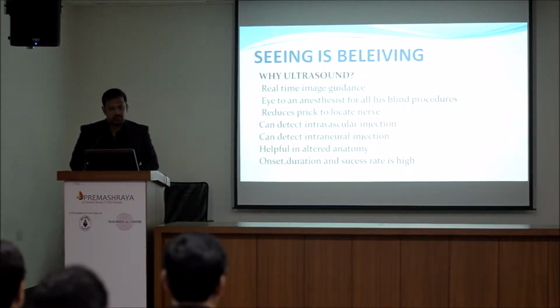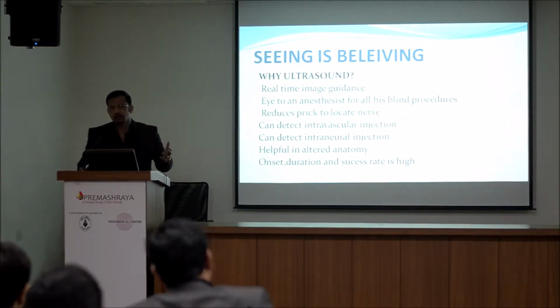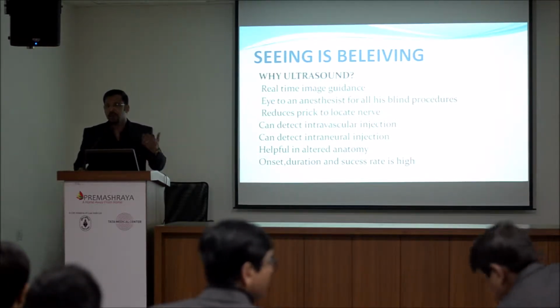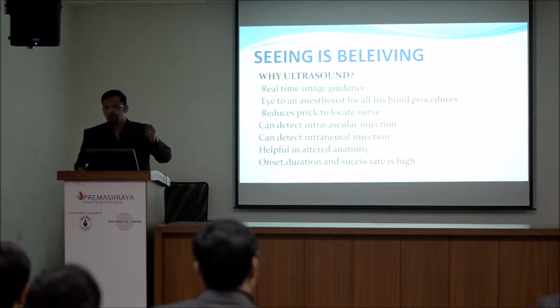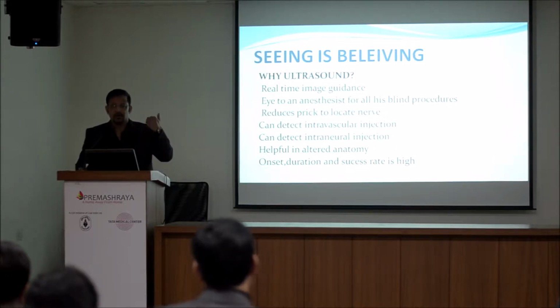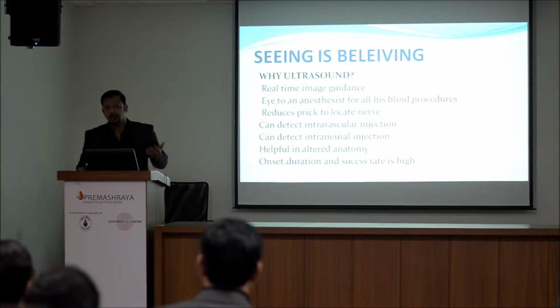Why do you need ultrasound? Obviously, it's real-time image guidance, and it's an eye to us, because earlier we used to do a blind procedure. It was all landmark guided or PNS. But if the anatomy is altered, it will be very difficult for you and for the patient, just poking around with a PNS, with a landmark technique. But if there is an altered anatomy, you can see in ultrasound, and you can just give it. It's very pain-free to the patient also.